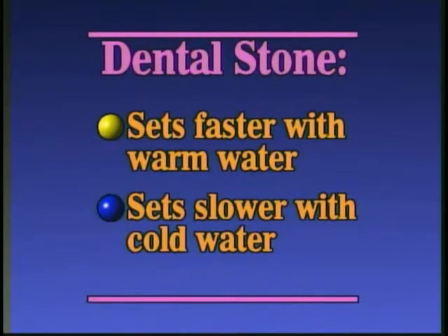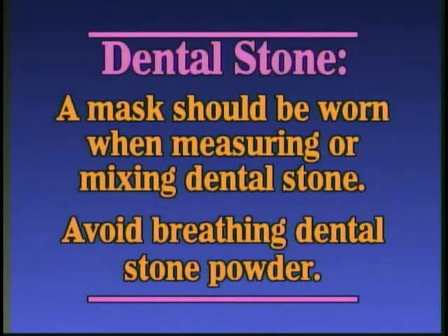Just like alginate, dental stone has the following properties. Dental stone sets faster with warm water, it sets slower with cold water, and a mask should be worn when measuring or mixing dental stone. Avoid breathing dental stone powder into your lungs.